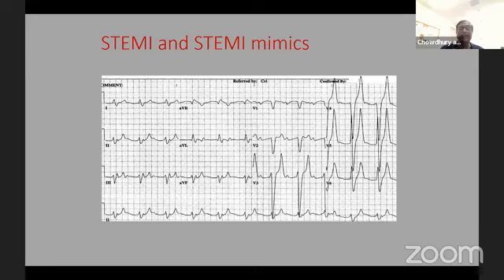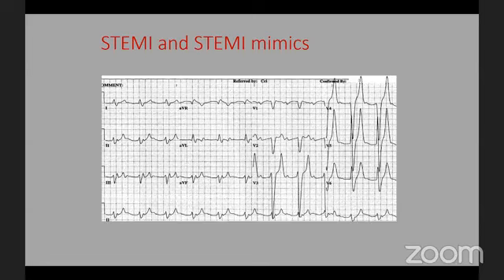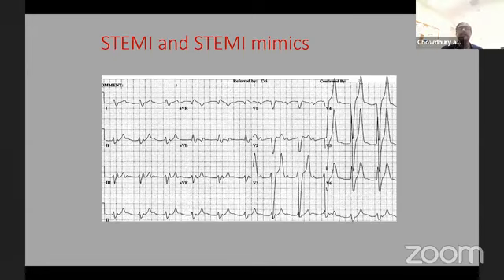But I will tell any younger physician to ask, what is the clinical context? Why are we looking at this EKG? How did the patient present? The patient is diabetic, in lethargy, ketoacidosis, hyperkalemia. So knowledge gives you assurance and calmness. If you don't know, then you will be nervous, thinking about MI and all that, and make yourself anxious, and also the family members anxious.